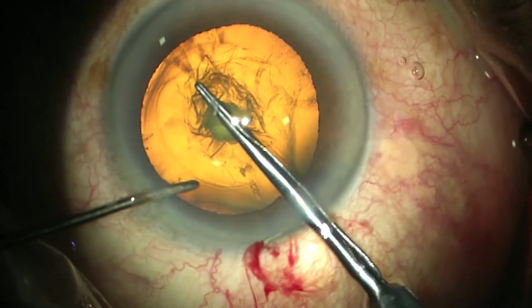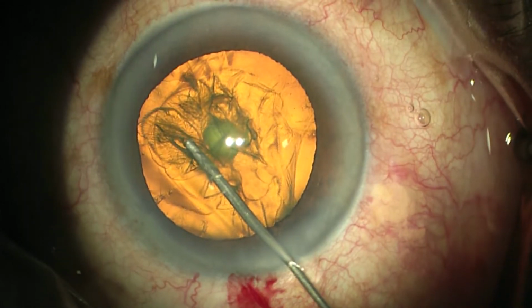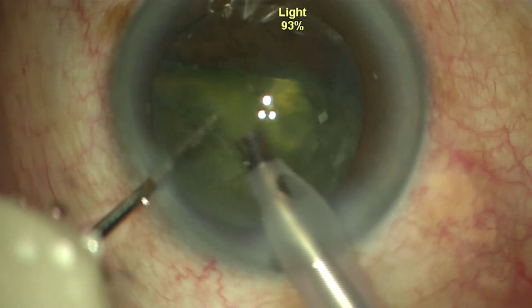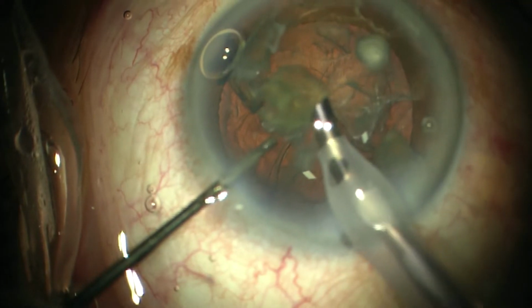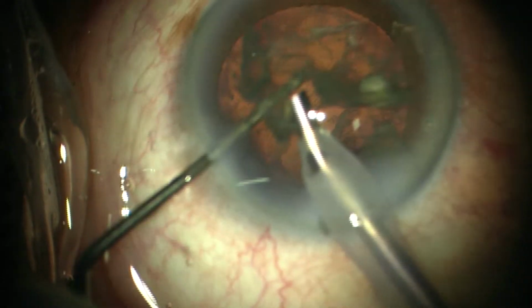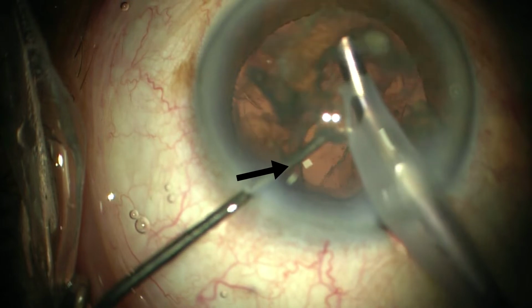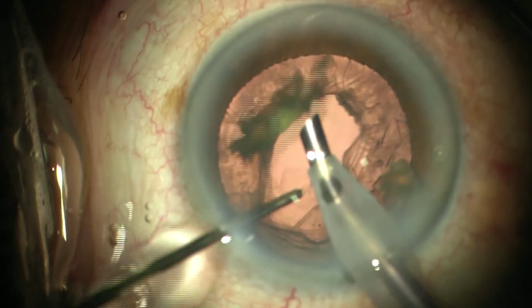A case of posterior polar cataract, wherein the same principle is followed. There is a dehiscence in the posterior capsule, and I can see the two typical pillars in the posterior capsule, which is very typical of posterior polar cataract with pre-existing dehiscence.